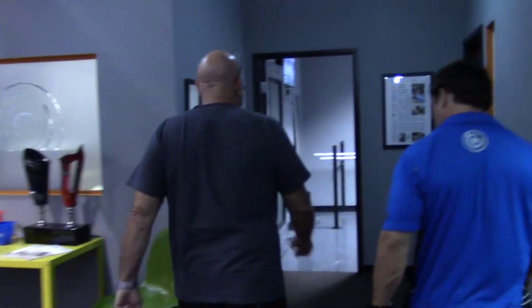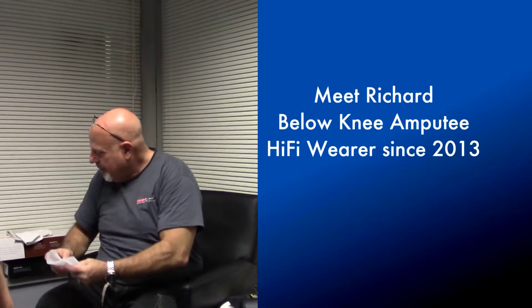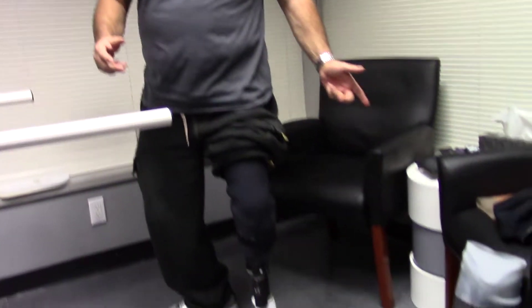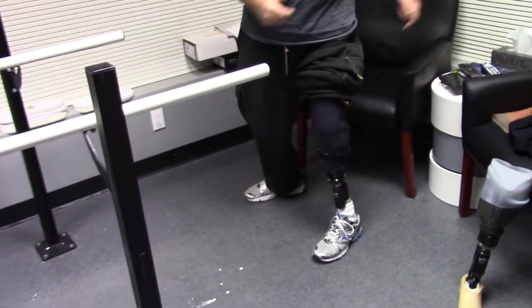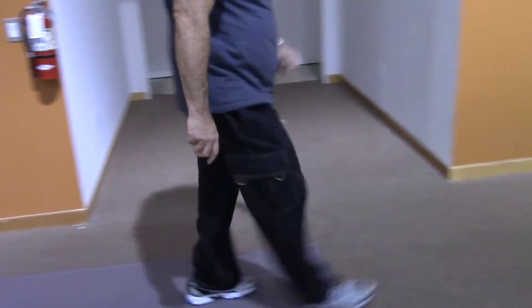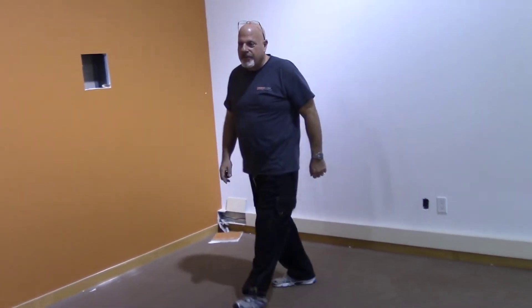When I first got in that, it felt so much better — this part just rotating. You're not having to worry about your socket slipping if you're pivoting, playing golf, swinging — your foot's not sliding out of your socket. What I really anticipated with this level was simply a better push off.